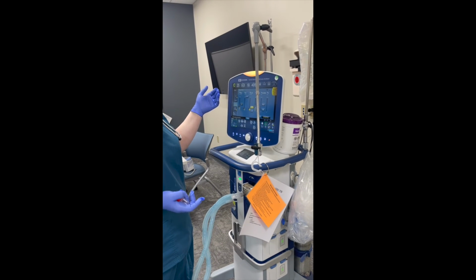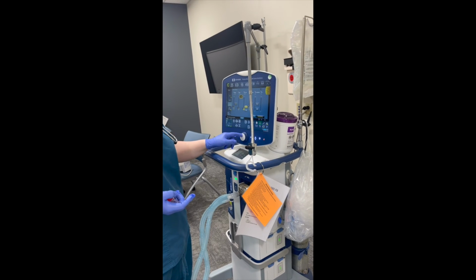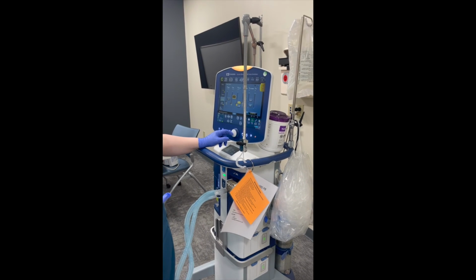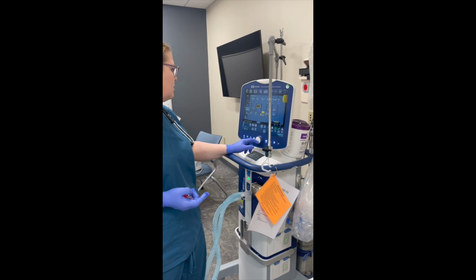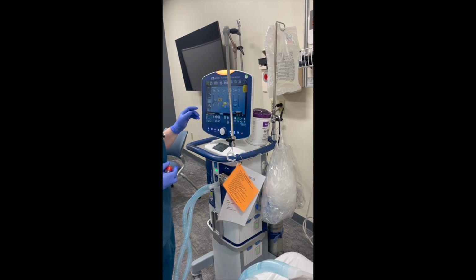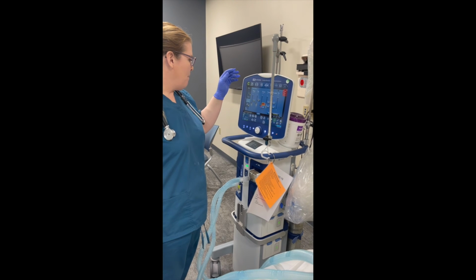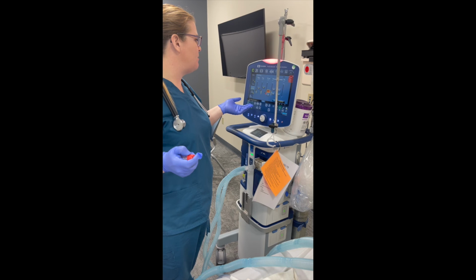And for a frequency, we'll do 10 above. So we'll do 26 because his respiratory rate is at 16 right now. And minute ventilation. So I'm gonna set my minute ventilation, and so let's say 10%, our minute ventilation is supposed to be 8.